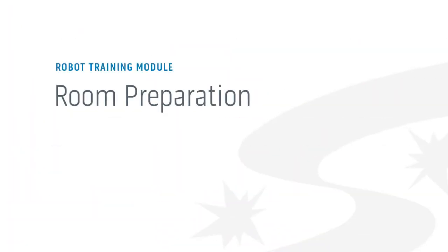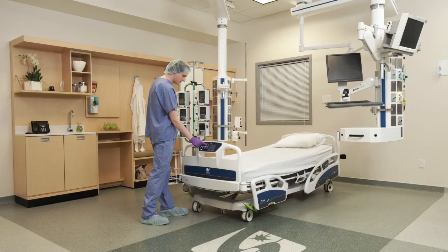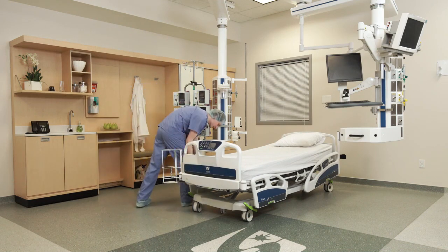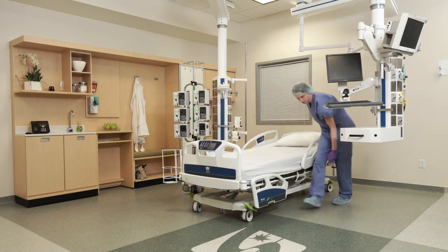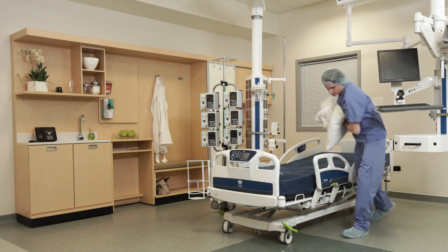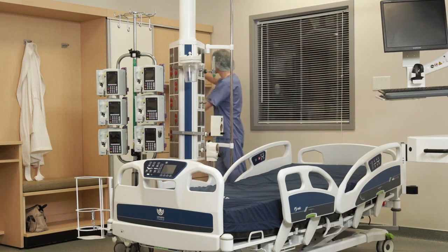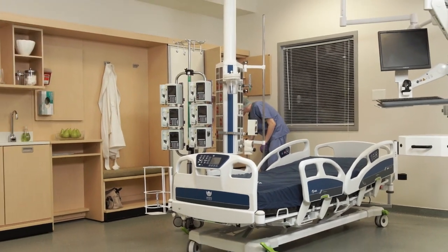To use your UVC robot, you'll first need to properly prepare the room. Starting with the patient room: raise the bed frame and guardrails to expose all surfaces. Pull or raise the curtains and rotate the blinds horizontally, stagger drawers and cabinets, recline chairs, and remove the phone from the cradle.